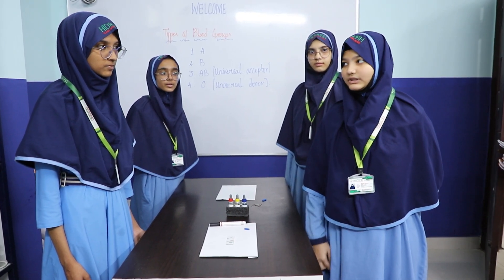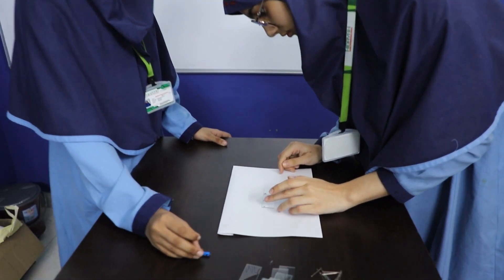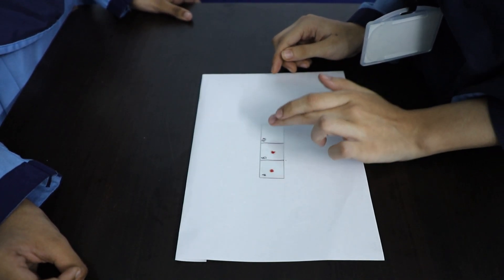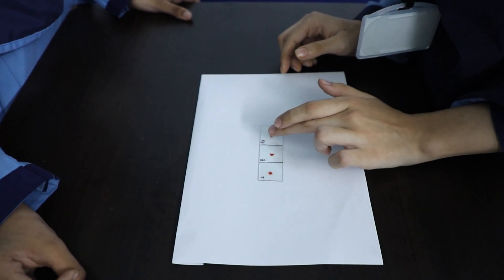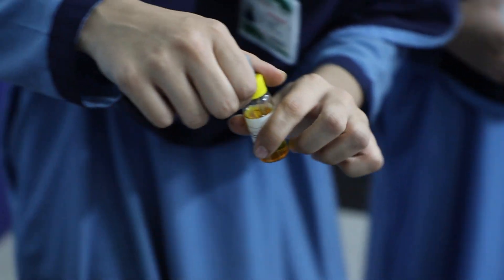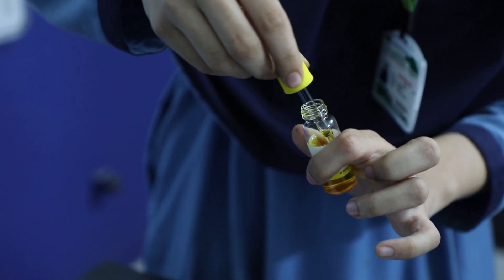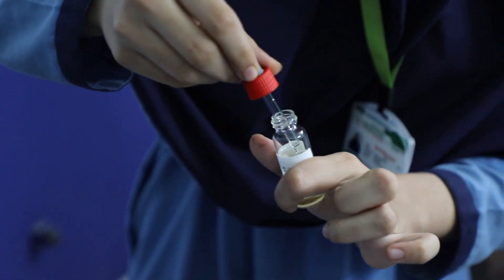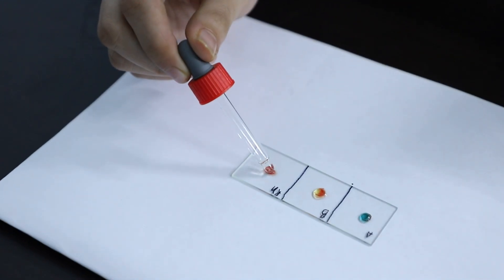While doing this activity, we got to know that her blood group is O positive.